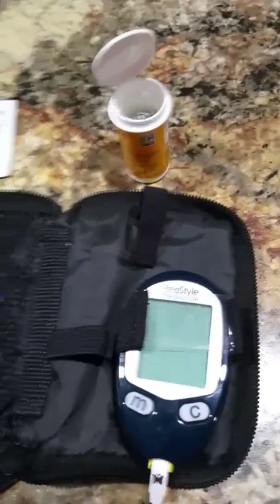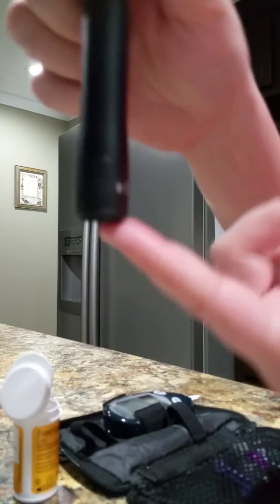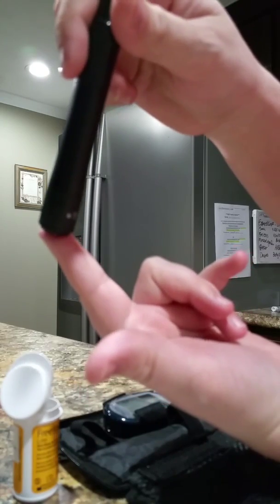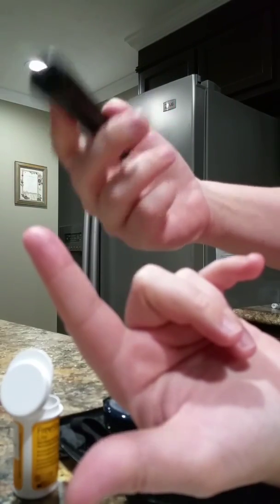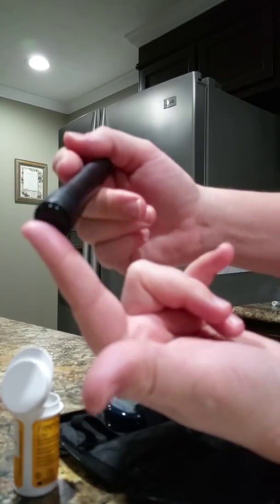Okay, so let's see if I can set my camera up here so you can see how to do it. Sorry. Okay, so here's my fingertips. What you do not want to do is put it at the top like this, because it's going to hurt worse than it has to. And if you put it in the middle of your finger, it's also going to hurt worse. So it's got that little hole. You want to kind of get it on the side of your finger, but towards the middle.